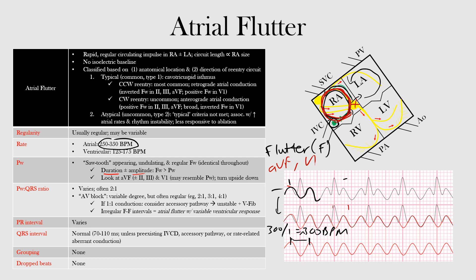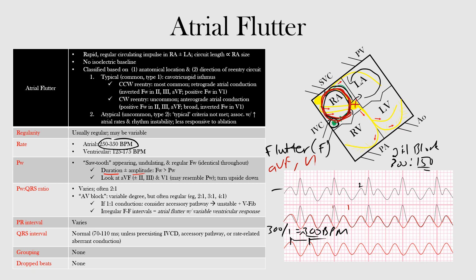On the EKG we can see one flutter wave, then a QRS, then one, two flutter waves before the next QRS — this is a 2:1 block. With an atrial rate of 300 and 2:1 conduction, the ventricular rate is 150. There are two thick lines between QRS complexes, confirming 300 divided by 2 equals 150 beats per minute. The 2:1 block is the most common pattern.